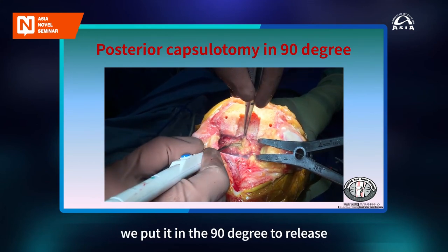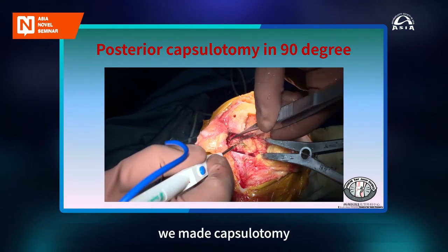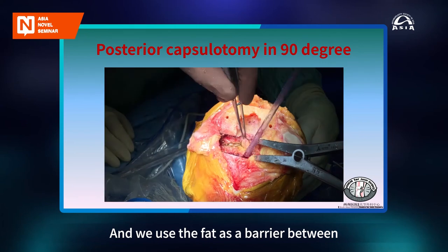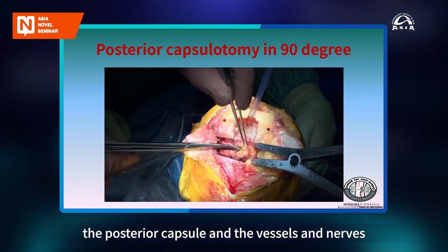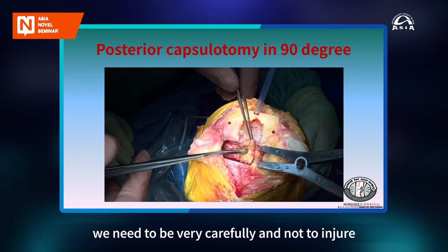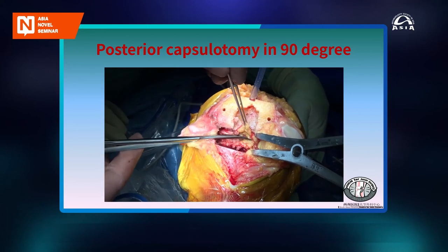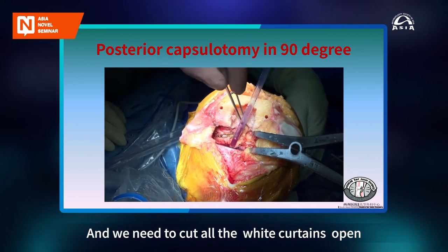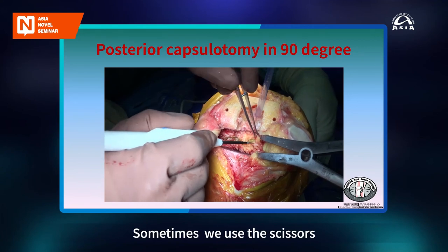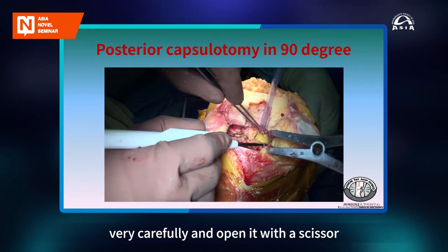The difference is that we put it at 90 degrees to release, and very carefully we make the capsulotomy. And we use the fat as a barrier between the posterior capsule and the vessels and nerves. But when we are doing this procedure, we need to be very careful not to injure the important posterior structures. And we need to cut all the white curtains open. Sometimes we use the scissors, and we just try to find the white curtain very carefully and open it with the scissors.